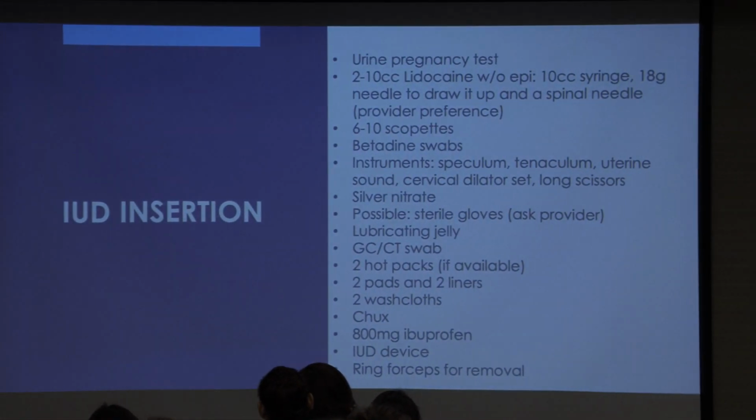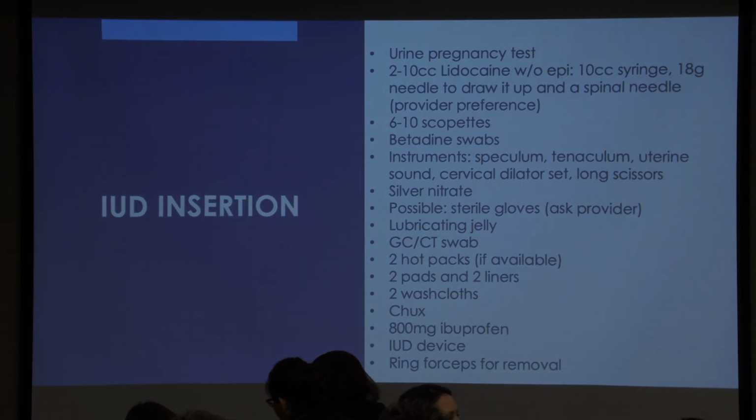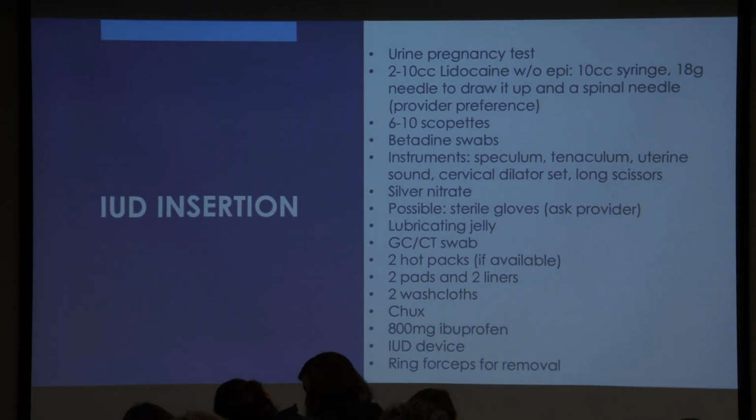And I get to share with you today a tray setup for our LARC, our long-acting reversible contraceptive devices, and supplies and tools, instruments that we use. So moving forward, just beginning with IUD insertion and setup and tools needed, instruments, supplies.